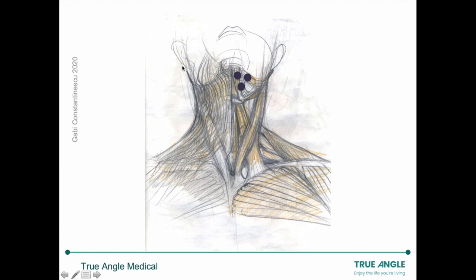And then the two active sensors go on, at least in my case, the anterior belly of the digastric. However, these are surface sensors, they go on the skin. So you can see that there are a lot of muscles around here, and so probably what's happening is we're picking up some activity from the mylohyoid as well, the geniohyoid, the platysma.